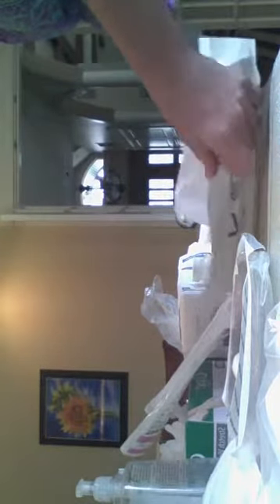These are the standard 7.5 gloves that come with the school's lab kit that you can purchase. 7.5 seems to be about where I am. I find with the wound, you want to make sure that you really have gloves that fit you well, because you don't want to be touching the edges, but for this it doesn't really matter to me. As long as I can get the gloves on my hand, I'm usually okay.